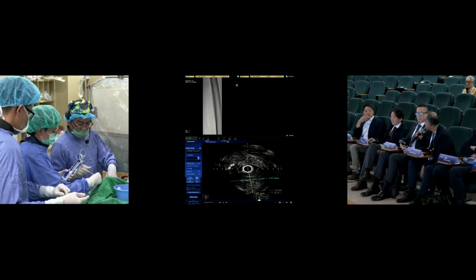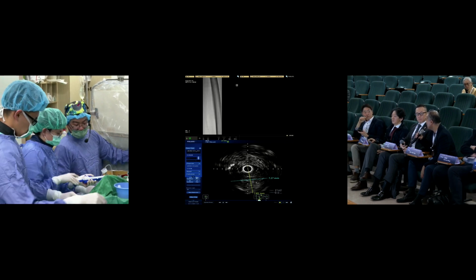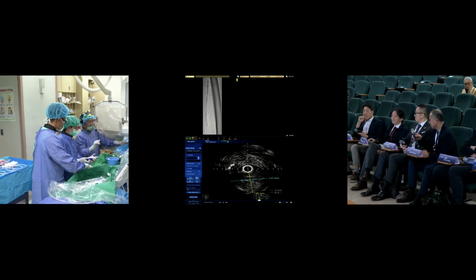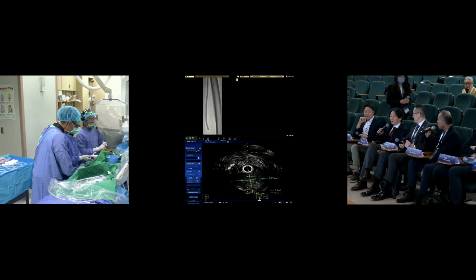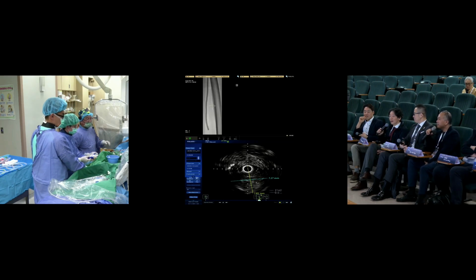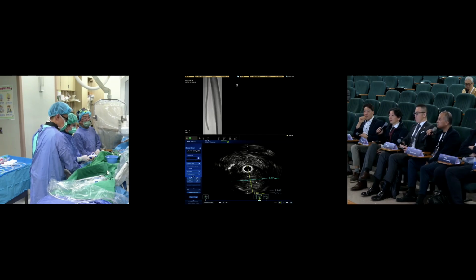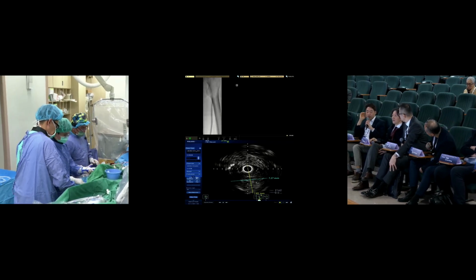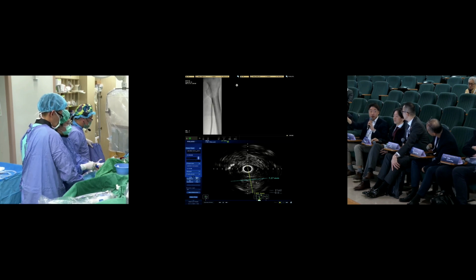I ask the panel, what do you think about how to deal with the ostial lesion? Are you more circumspect about the diameter of the vessel? Because you're always worried about dissection in this area. Yeah, I'm not brave. Initially, I use a 6 millimeter balloon. Usually 5 or 6 approximately first, and then if the patient has a bigger size, I would size up.